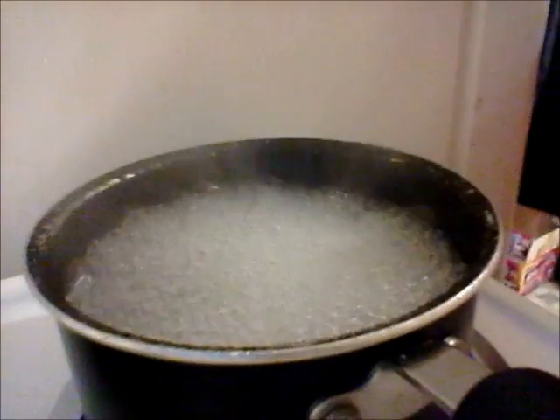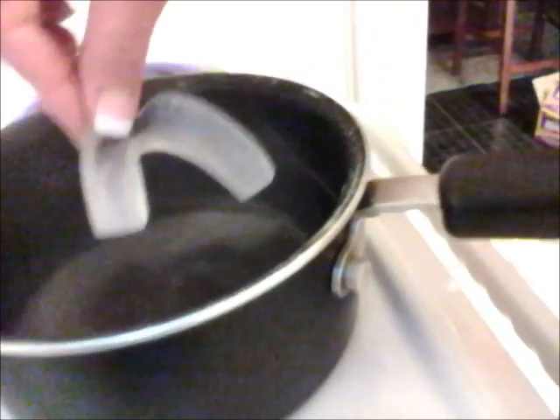Alright, now it says to bring about 3 inches of water to a boil. Then take it off from the heat. Let it cease to boil. And drop your mouthpiece inside. And leave it there for about 15 seconds. Then you want to get it out and set it on a paper towel to dry, to cool.